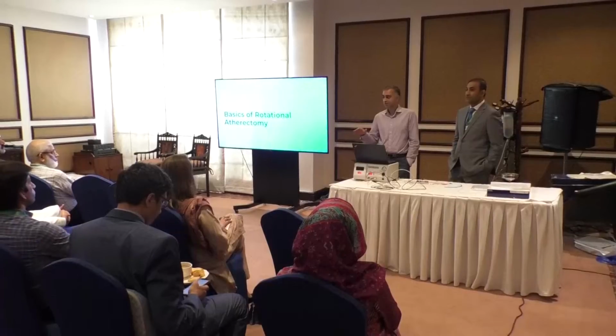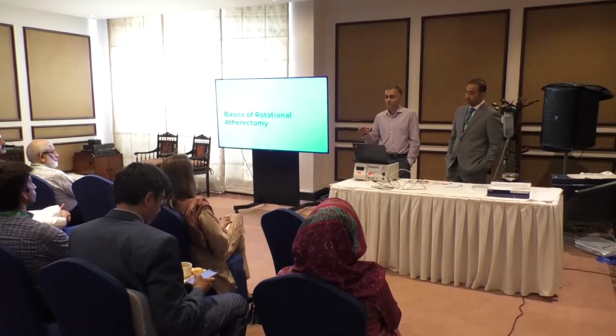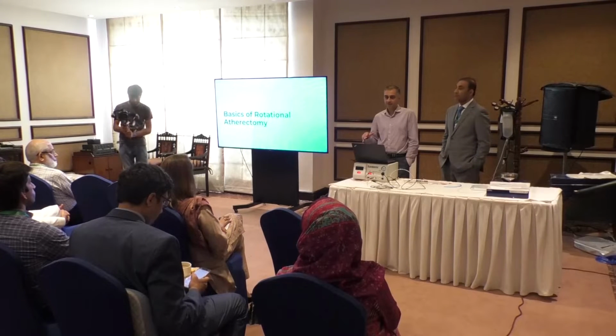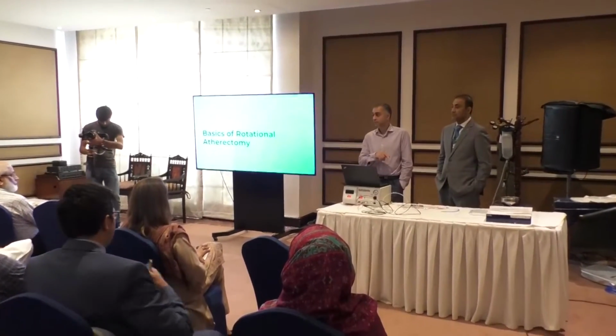As many questions as you can. You want to go away from this session being comfortable with the setup for rotation and the indications for rotation, and then later on in the session, we'll get you to doing the hands-on as well.